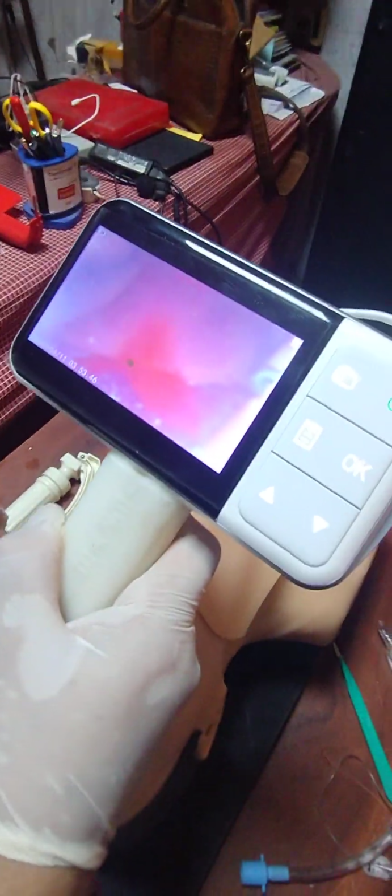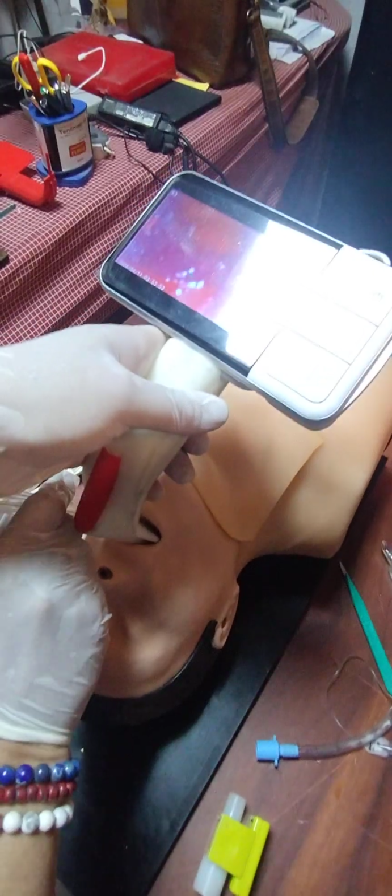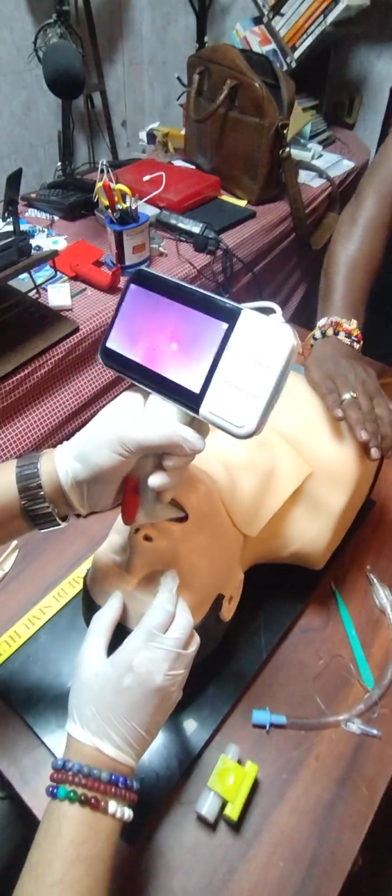Okay. So you must always keep it here, left angle. Hold this. Take it out, remove this. And again, the field is clear.